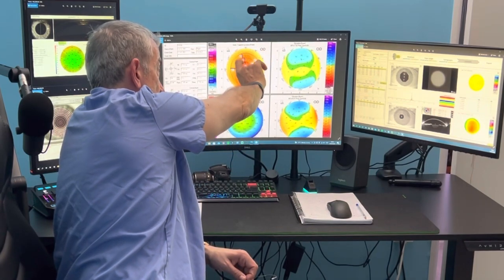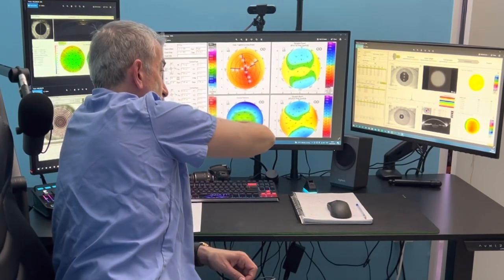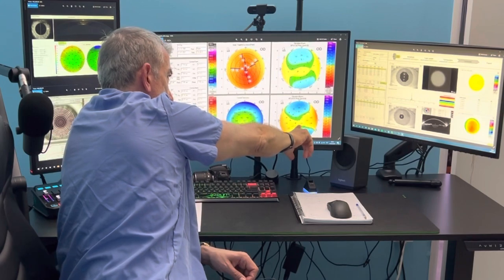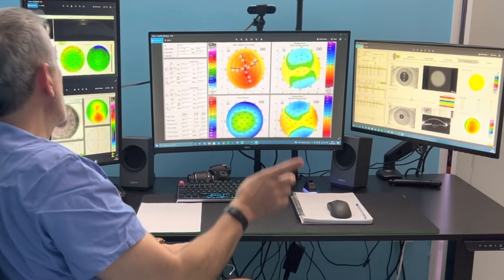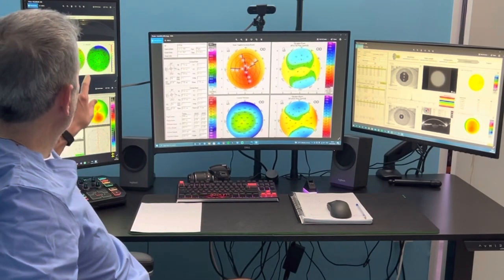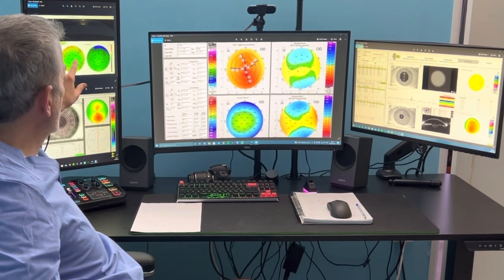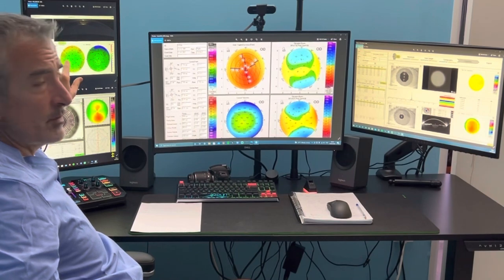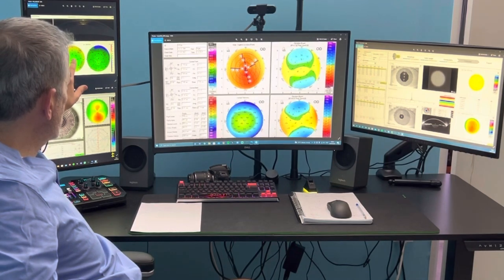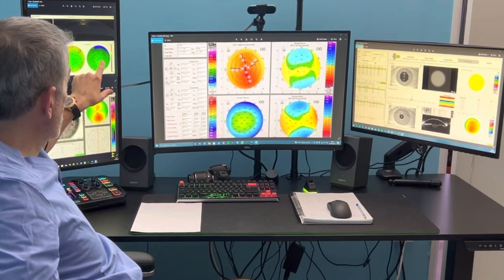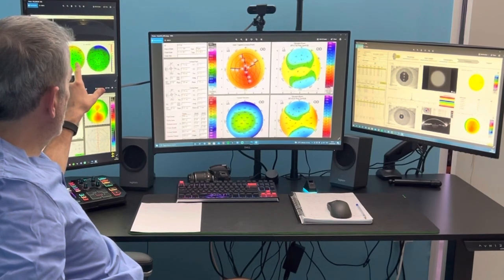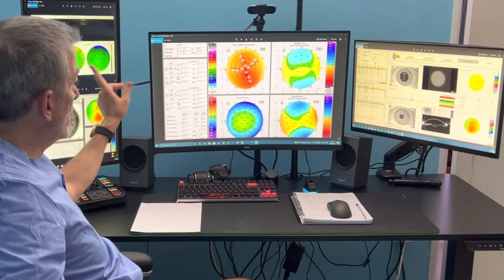There's some truncation of the astigmatism, and the astigmatism is steeper in the inferior part. We can see that the cornea is steeper inferiorly, and the posterior elevation is not perfectly centered. Going back on the anterior segment OCT, these are the Optive View pachymetry maps. We can also see there's a little bit of blue color in the steps that the Optive View device uses, and this tells us there's big variability of thickness that does not coincide with variability of thickness in the epithelium. We're looking at nine millimeters in both devices.